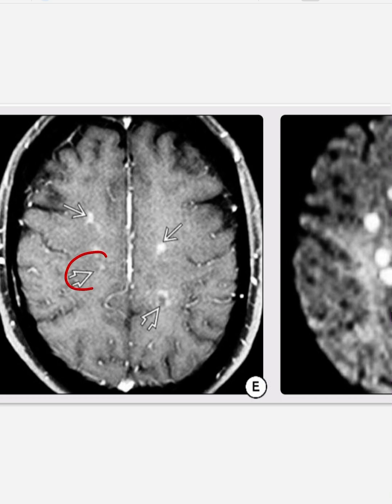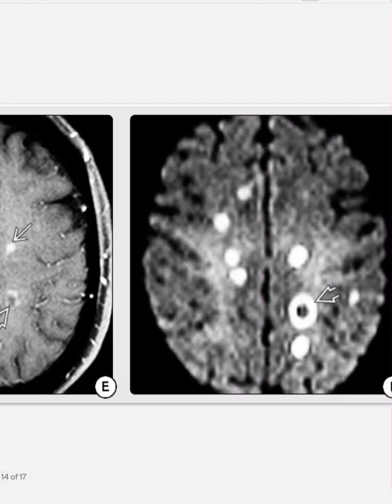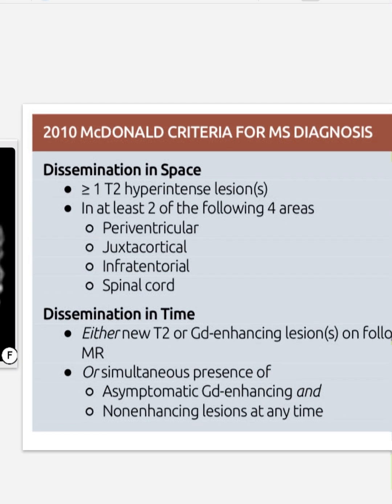Contrast imaging shows more punctate and incomplete ring enhancement in some lesions. DWI shows multiple foci of diffusion restriction with incomplete horseshoe ring enhancement, and diffuse restriction in the periphery surrounding a non-restrictive hypointense core. On brain biopsy, this case was concluded to be multiple sclerosis.